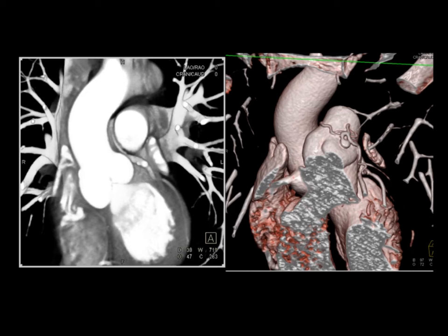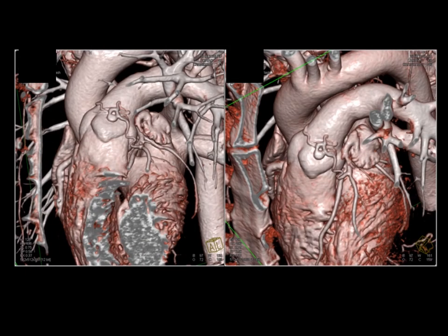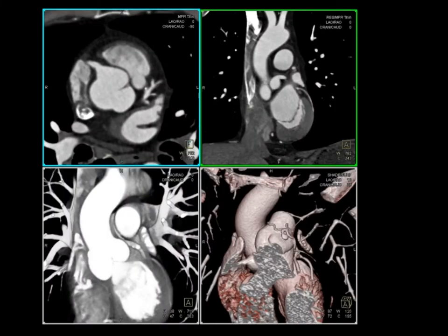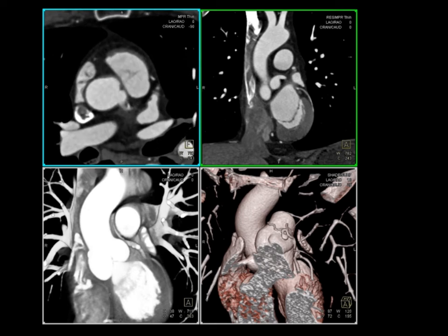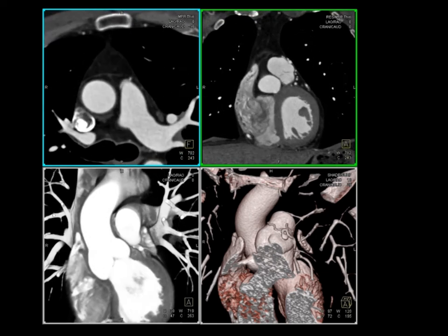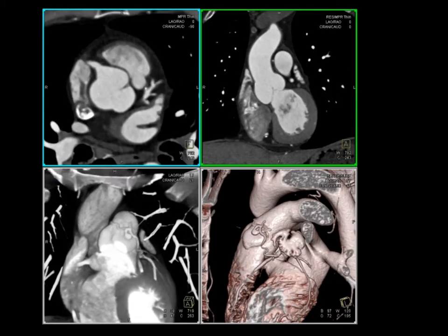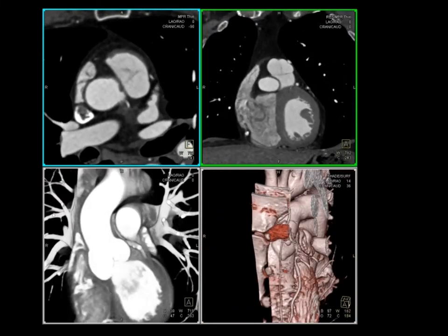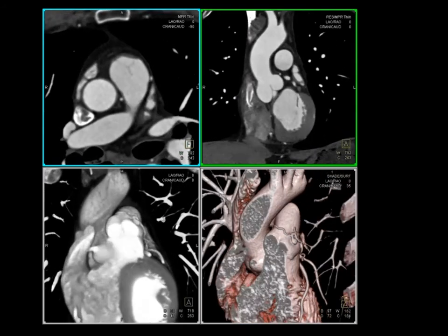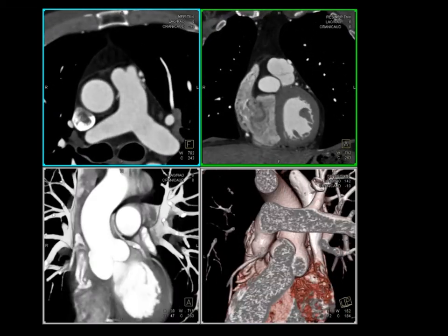If you take that from the volume rendering and then create a different view in color, you see that actually that vessel is going on top of the pulmonary artery — it looks almost like a button. And there are actually vessels going to the left and right on top of the pulmonary artery. Looking at it on four views with a little bit of motion, scrolling through the data sets, just following that vessel upward — whether looking axially, coronally, or in 3D — you can clearly see the vessel and its orientation. It's really a vessel we track upward, going up into the pulmonary artery, like a button-type appearance.